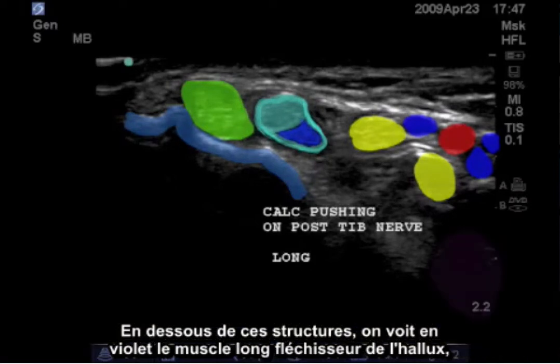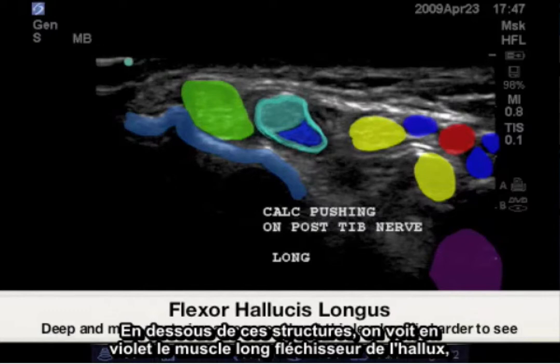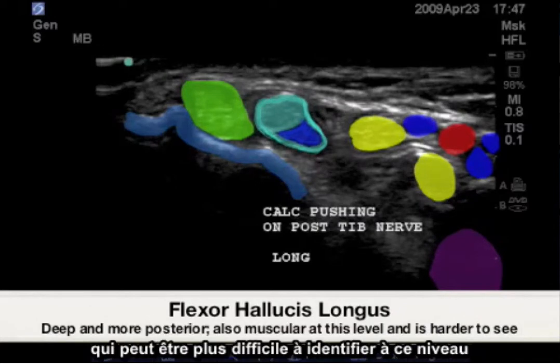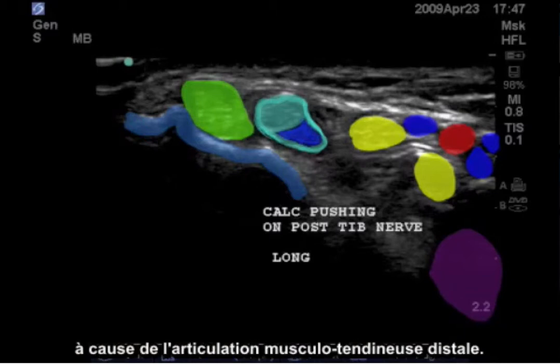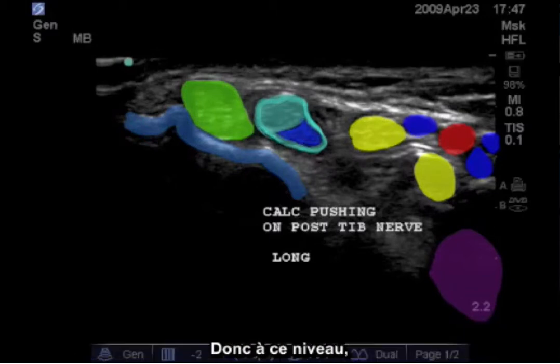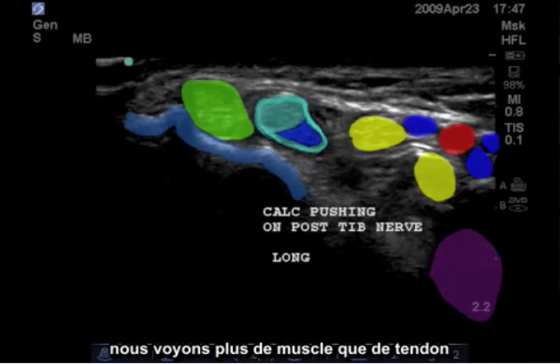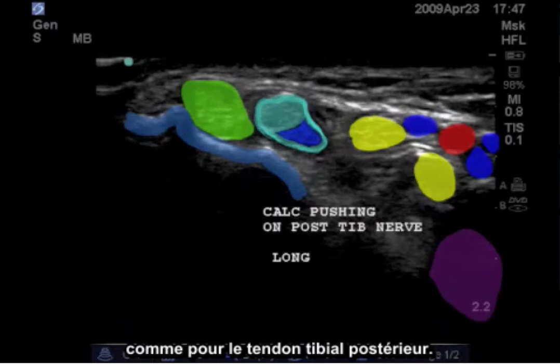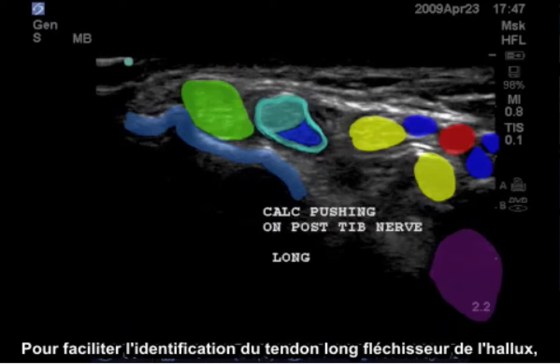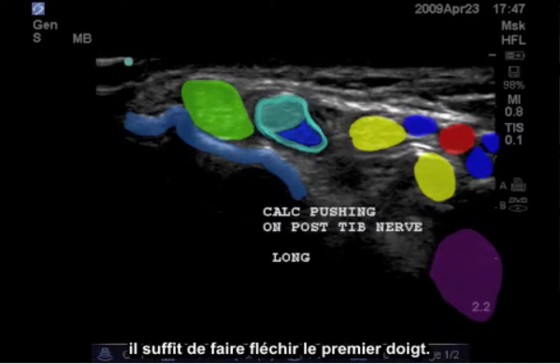Deep to these structures, noted in purple, is the flexor hallucis longus, which may be more difficult to identify at this level due to its more distal musculotendinous junction. At this level we are seeing more muscle than tendon, as compared to the posterior tibial tendon. To make the flexor hallucis longus tendon easier to identify, just apply flexion to the first digit.